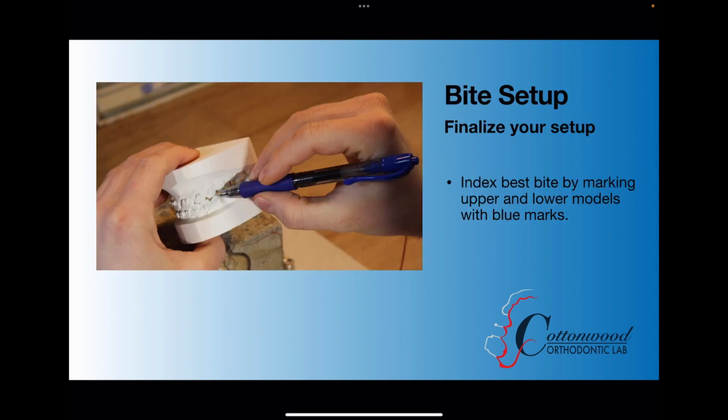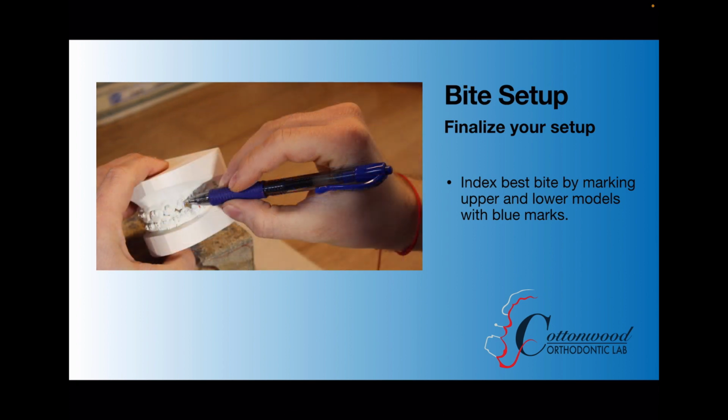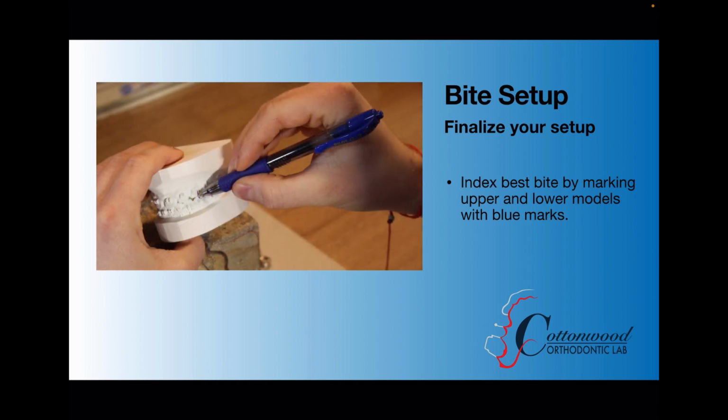So once you've finalized your bite setup and you're happy with what you see, I want you to mark either on your canines or your first bicuspids using the blue pin to indicate that's where you're going to be setting up your bite. So it's really important to understand where you're going. We don't really articulate these, so that blue mark indicates where we're trying to set everything up.